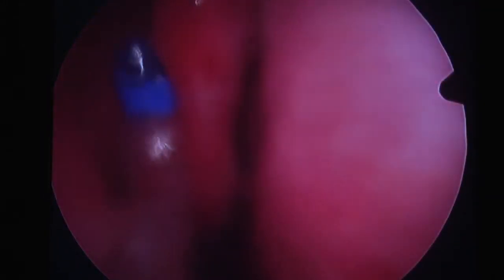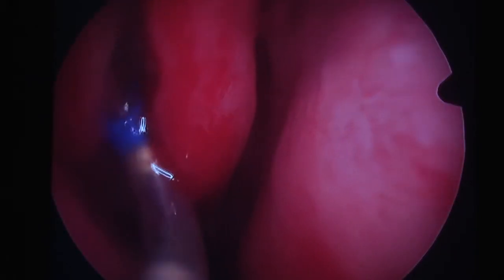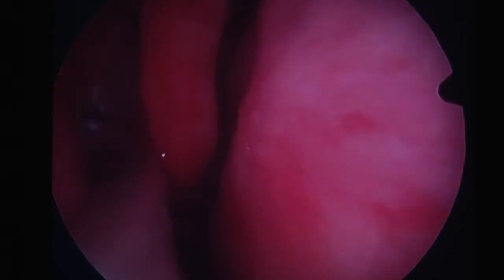Slide in here. We're going to move the tissue out of the way just like we did on the other side. Slide into the back — I'm going to advance the balloon, confirm that it's in your cheek, and it is. It's got a nice light on the outside. We're going to advance the balloon, and Julie again is going to inflate. And everything's out.